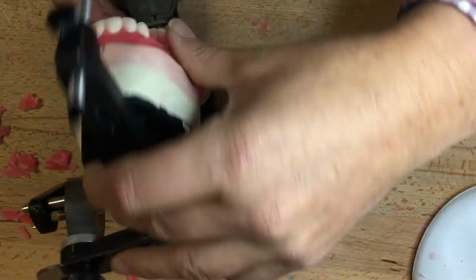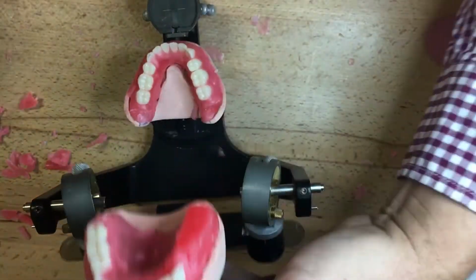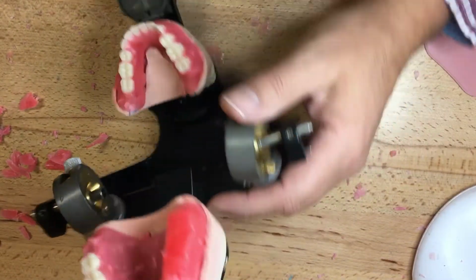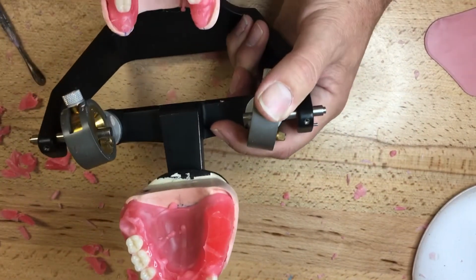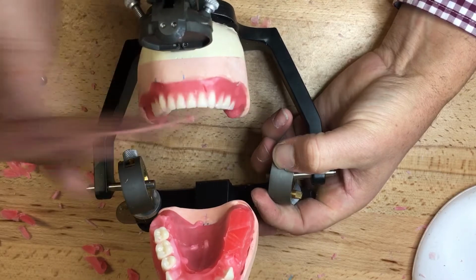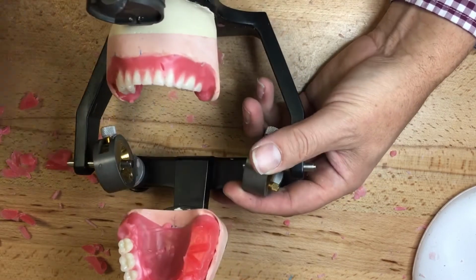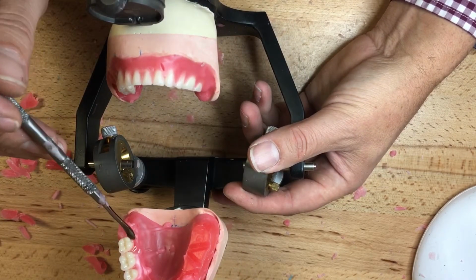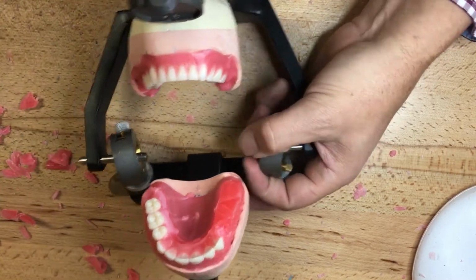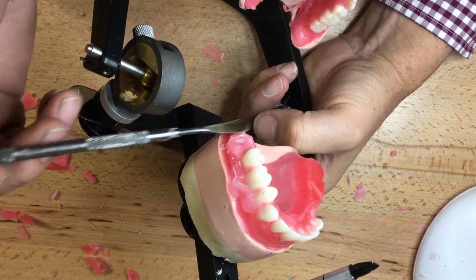I don't find it too taxing to increase the compensating curve of the lowers. But now, for education purposes, I need you to get this straight. With experience, you can incorporate that compensating curve into your setup, possibly by just using a flat plane to the mesial buccal cusp of number 6 of the lower, and then conversely angling them up compensating curve-wise. But you might say, well, why are we doing things twice? Well, for education purposes, if I can't get them flat, how can I even get them with an incline? So let's start just by making things touch a plane first. And then we can add some experience after and put that compensating curve in as we go.